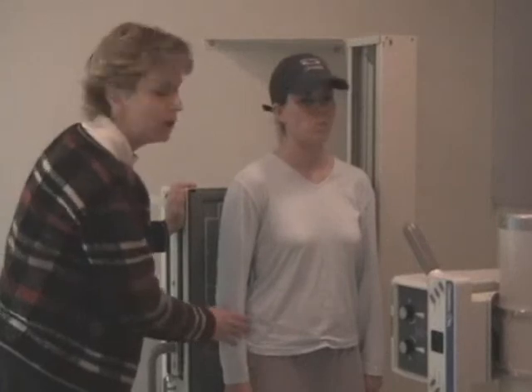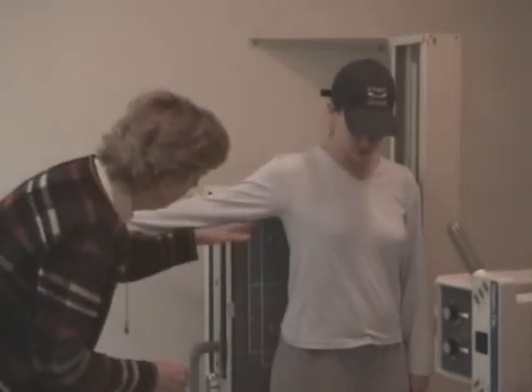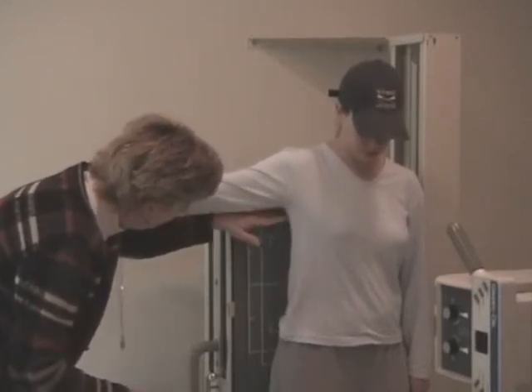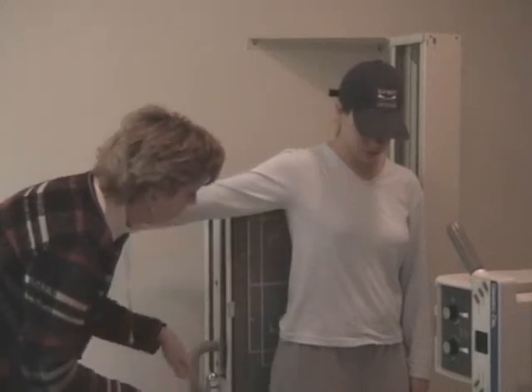Another trick that techs will use is they will have the patient elevate the arm, and they will look at the top edge of the film with the axilla. If the film's edge is real close to the axilla, again, they will not clip diaphragms.